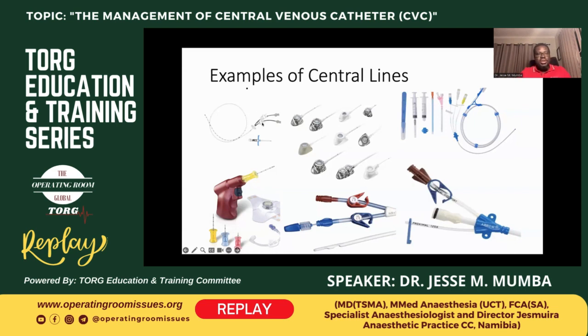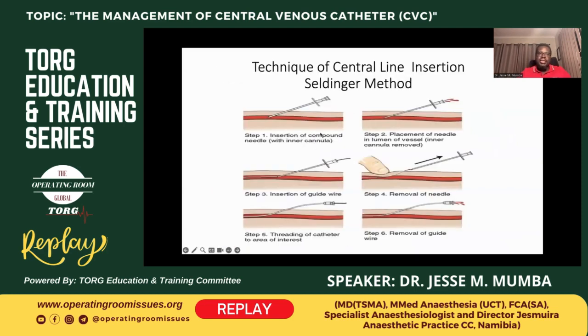This is how the PICC line will look like. This is peripherally inserted, so it's quite long and it's tunneled up, and these are chemo ports. So we put them into the central compartment and we bury this port under the skin.